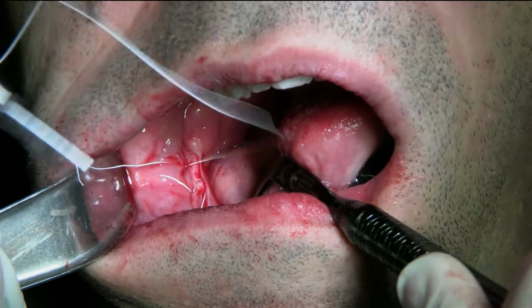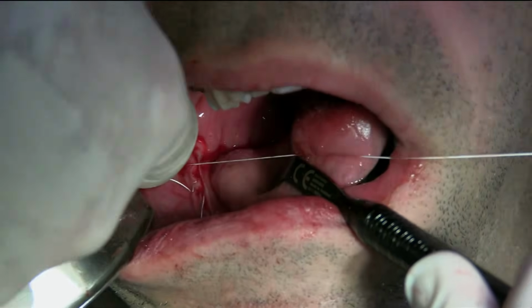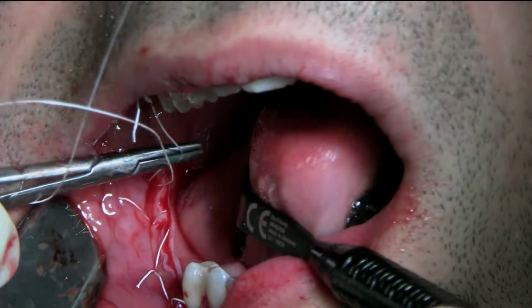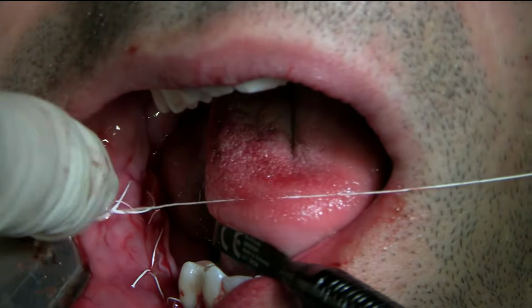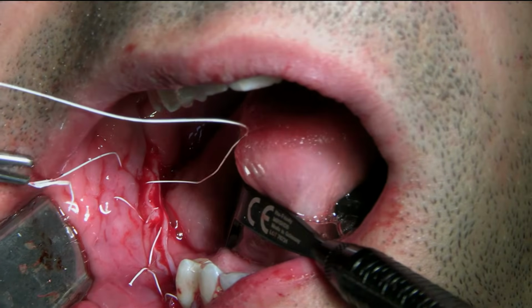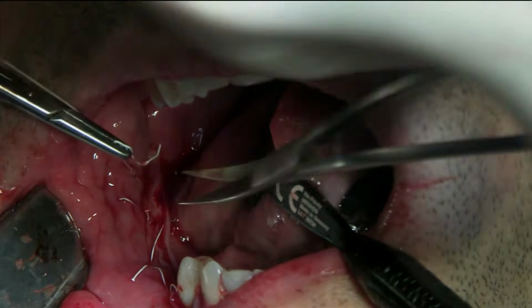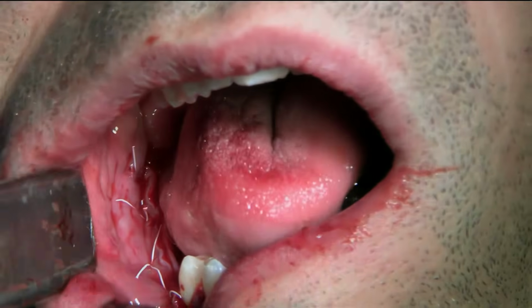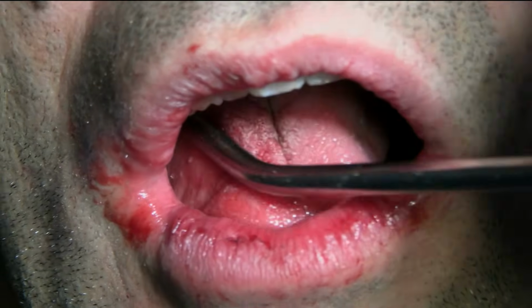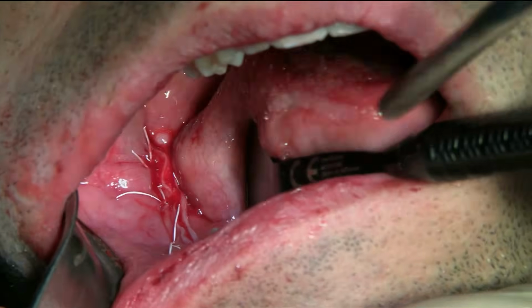There we go. Again, it pops up. Retract the anterior leg. You can see the key to this procedure is really how much soft tissue I have coronal to the membrane. Okay, we want to now show the occlusal, retract the cheek. Retract the tongue.